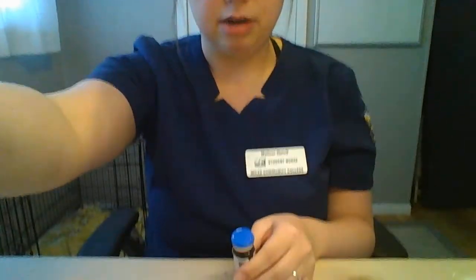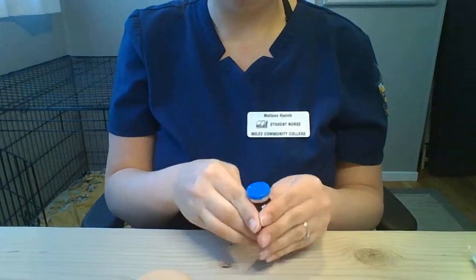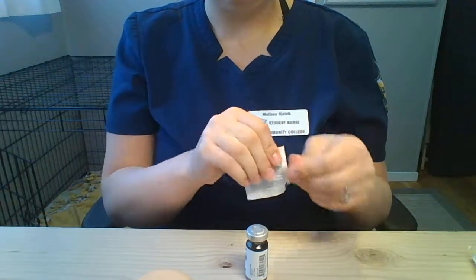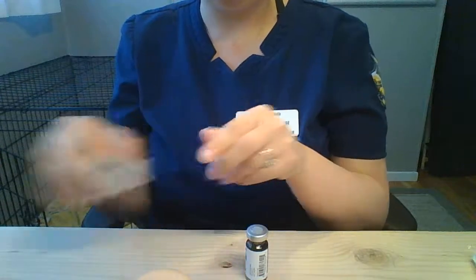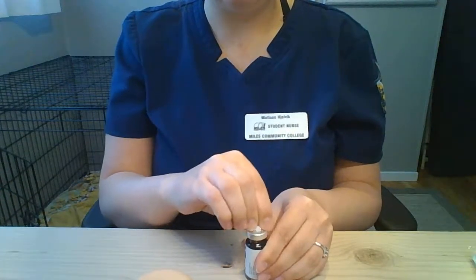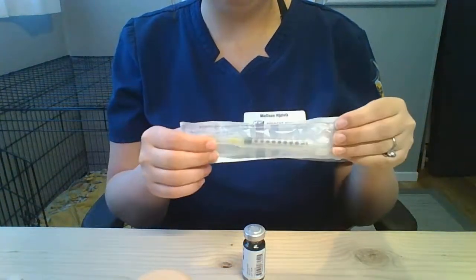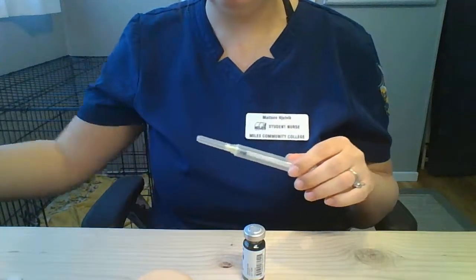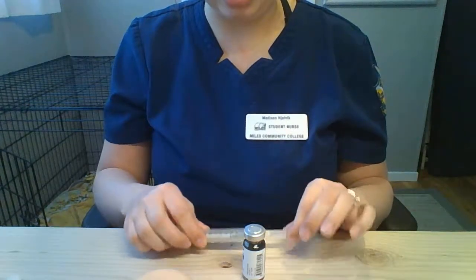I'm going to push this down. Remove the cap and clean the top with an alcohol swab. Then I will take my needle, remove it from the packaging, and carefully remove the cap.